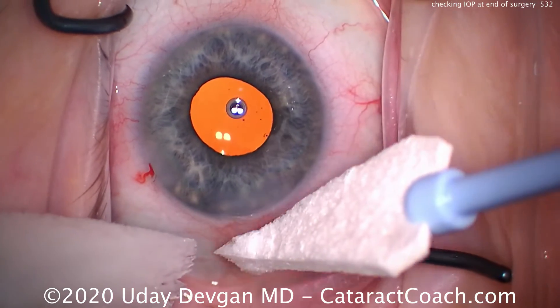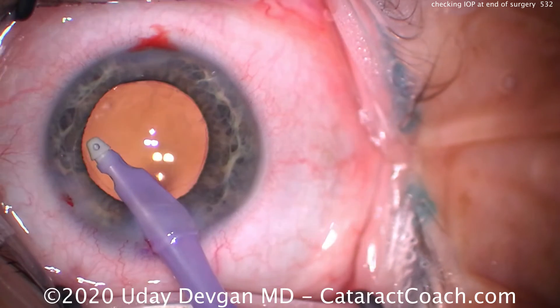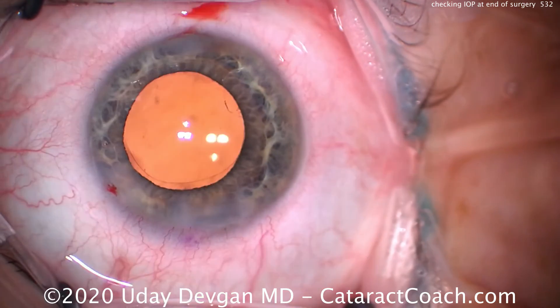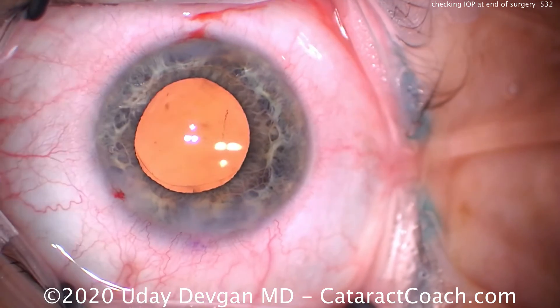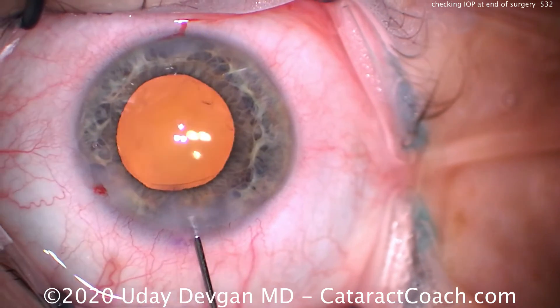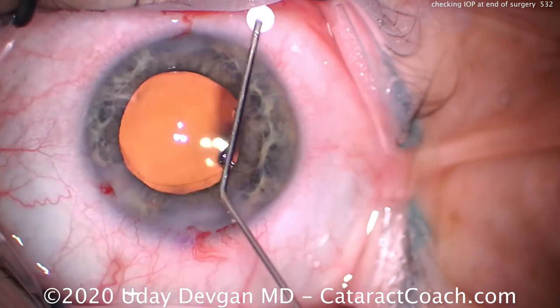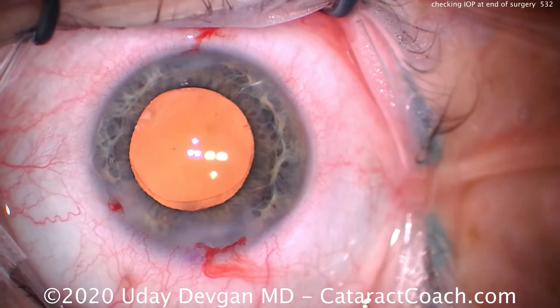Some people use a finger to push on the cornea or palpate it — I'm not a big fan of that. Let's look at another case. Again, at the end of surgery, the IOL is in the capsular bag, removing the viscoelastic. Everything looks great. Let's seal the incision with some balanced salt solution, hydrating the incision back and forth — just enough. Checking the pressure, seems pretty reasonable.